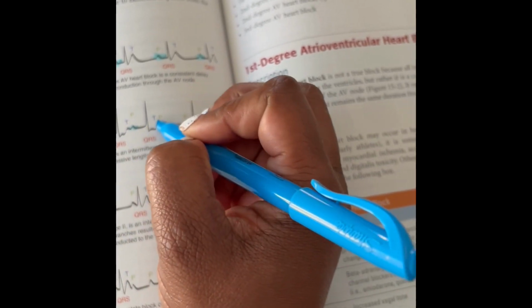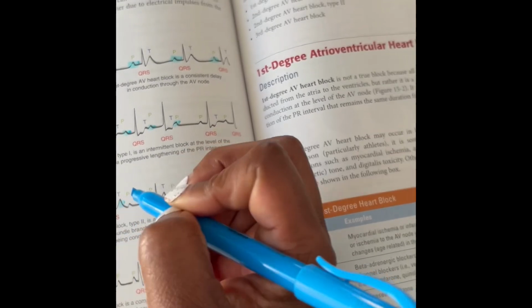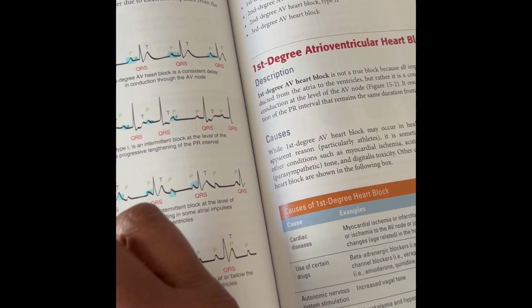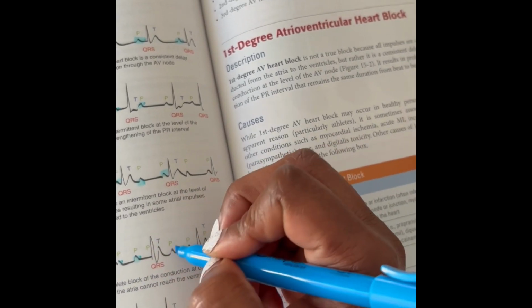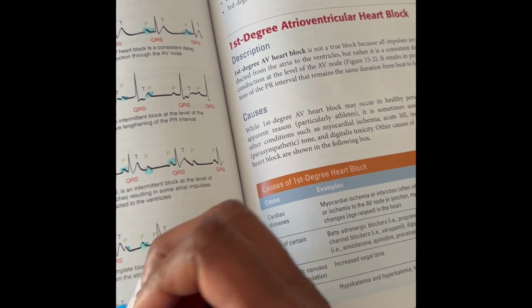And as I'm going through them, I won't do all of them. Oops, sorry, I did one T. Remember that the P wave initiates the atrial contraction. So I call them atrial atoms. We're gonna name them Atom, right?